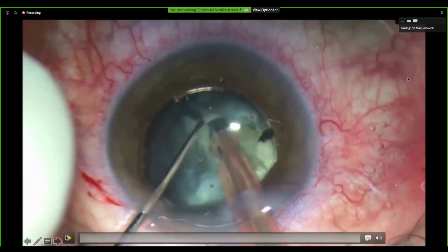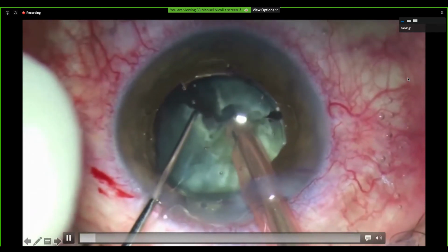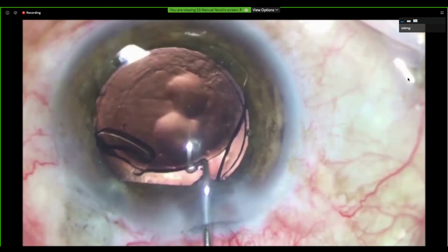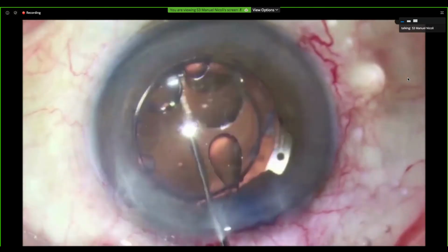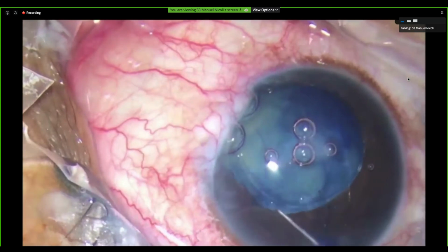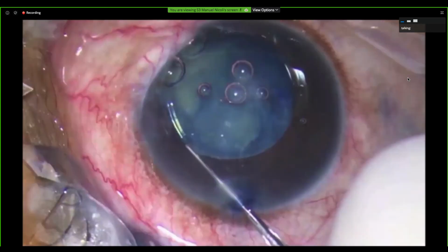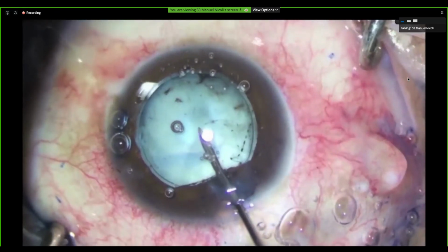ring. Here we're seeing a very hard cataract surgery with lens pressure into the ring, and you see no movement on the ring. Then we're gonna see a posterior capsular rupture in an eye with a vitrectomy, and some sectorial iridectomies and colobomas where you can use it, and posterior synechia. You can use them in those cases.